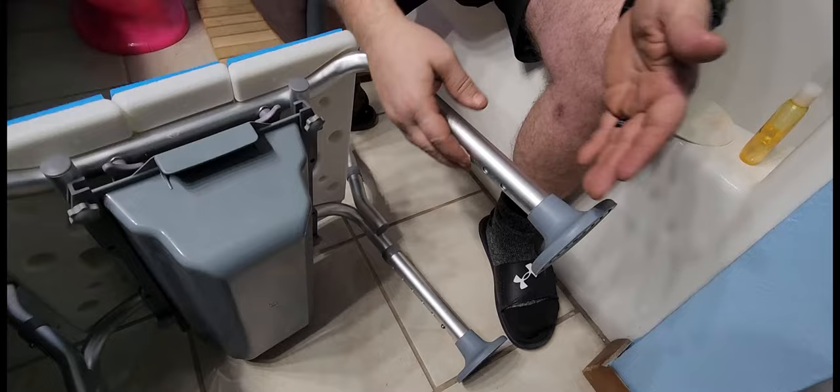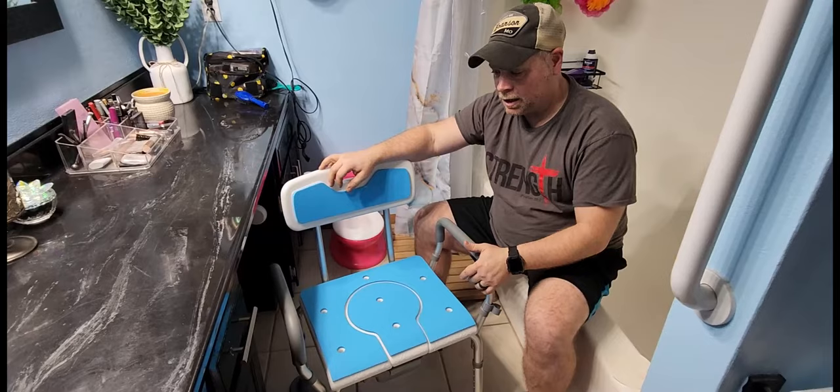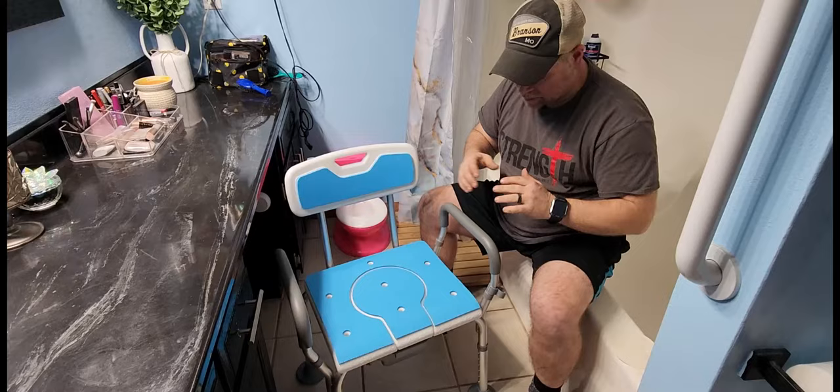We just picked up this four-in-one shower chair and commode for my mother-in-law who's getting ready to have knee surgery. We thought this would be really helpful for her to have close to the couch, and you can also put it in the shower. You had to assemble this from the ground up — put all the legs in, all the screws in — and it was really simple and easy to do.